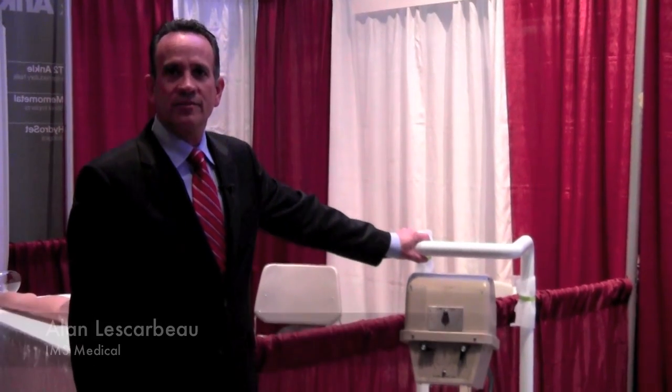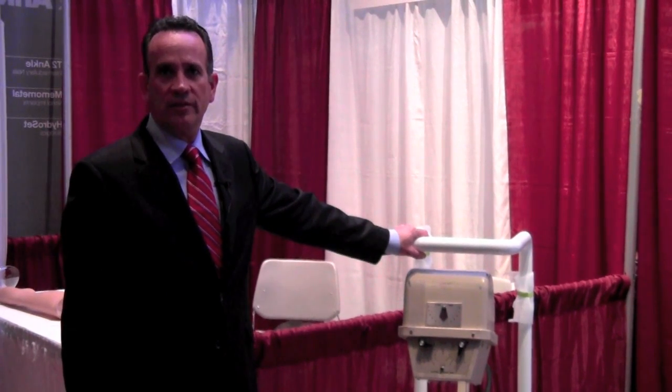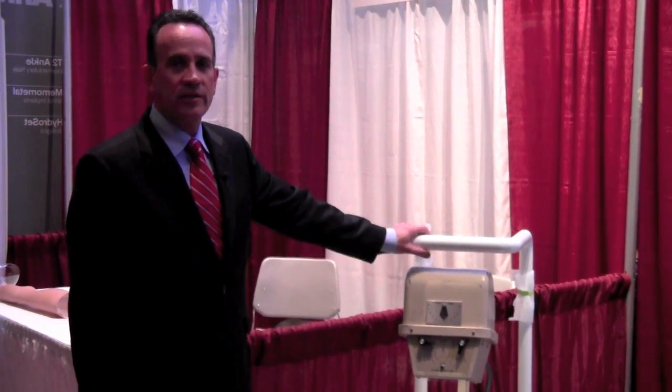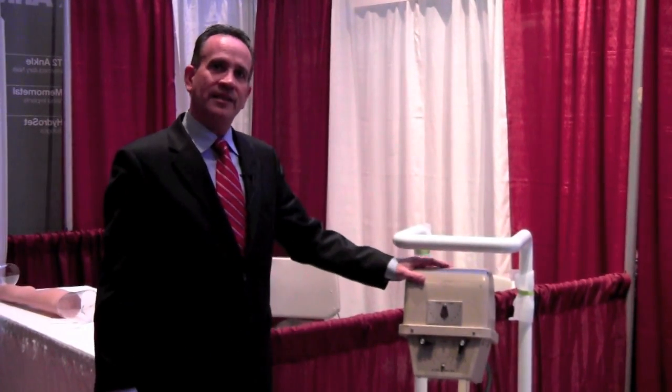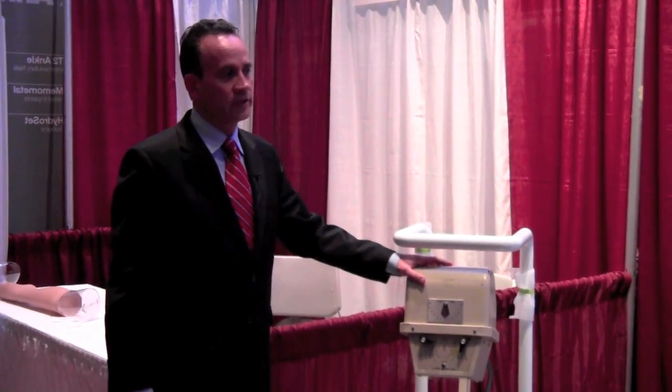Hi, good afternoon. My name is Alan Lescarbo and I'm with IMS Medical, and I'm here to demonstrate the Padre digital x-ray system. This Padre digital x-ray system is a direct radiology system, meaning a DR system for direct radiology.